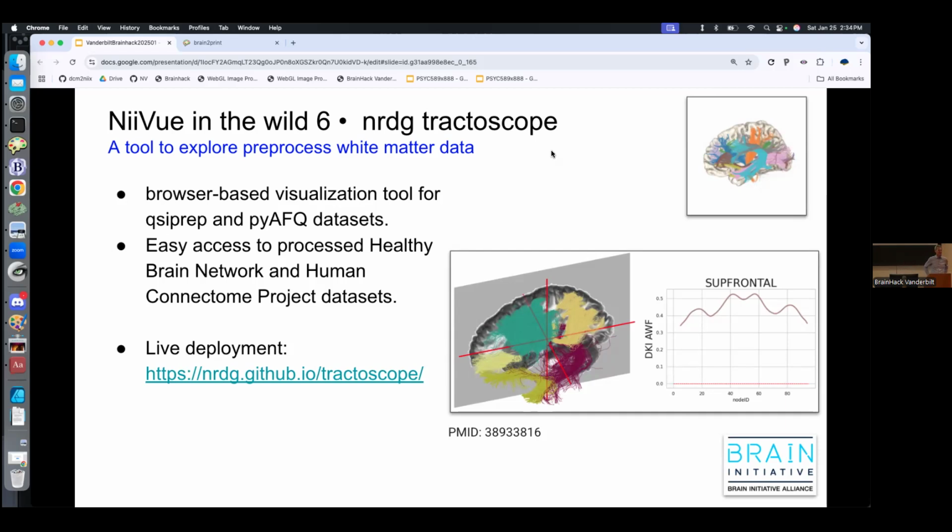So I'm sort of curious, let's say I want to use this tool and I have some images. What's your workflow? Are you running the local server and editing those web pages, or are you on the cookbook examples and you see, okay, here's the overlay, how do you replace those files? Is that something that you have to do in the JavaScript?